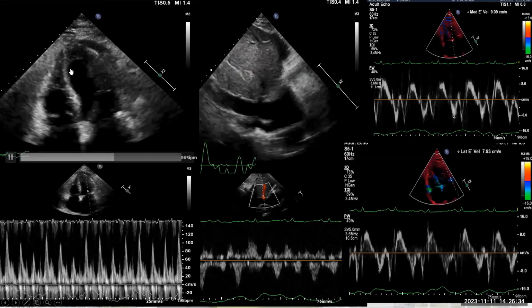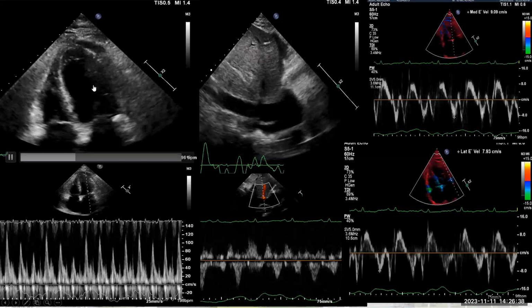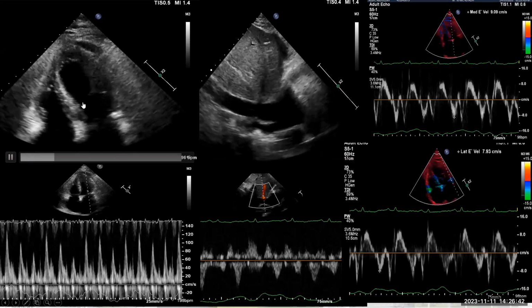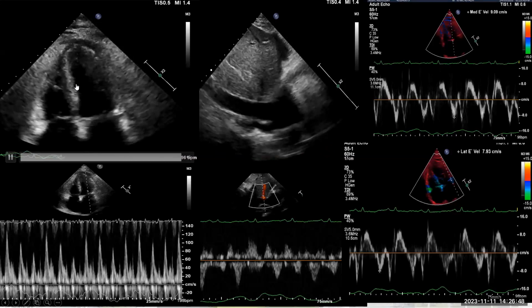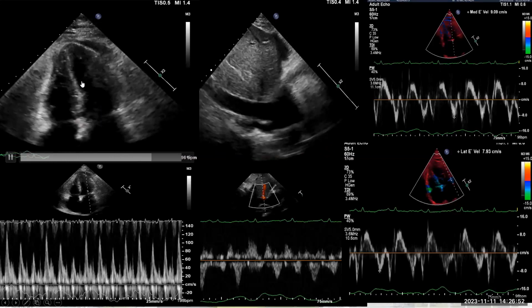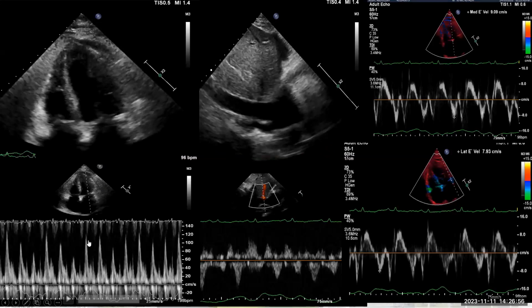This is because of interventricular dependence, respiratory variation between inspiration and expiration in the pressure of the RV. That's why the septal motion will change and go toward the chamber that has low pressure in diastole. So the septal bounce, and this is mitral inflow.